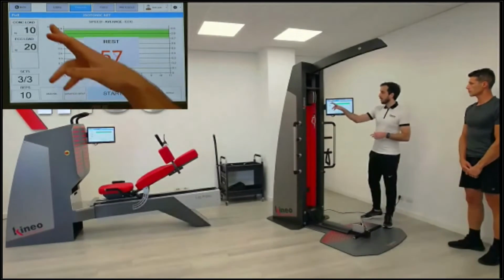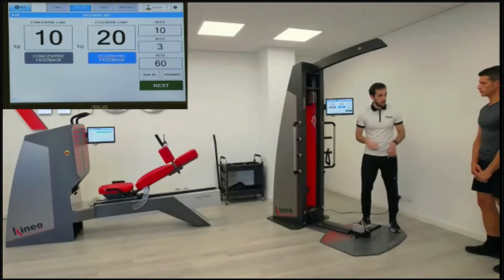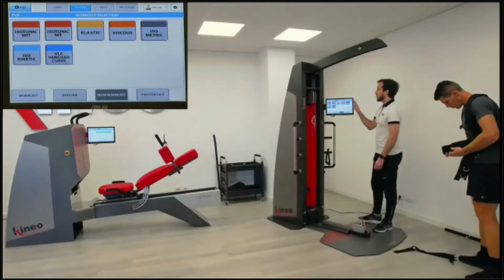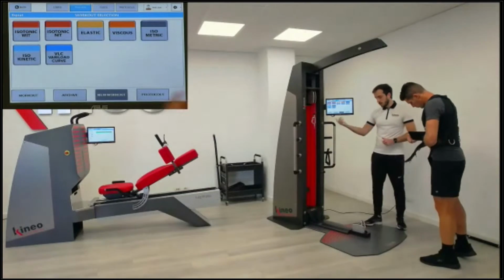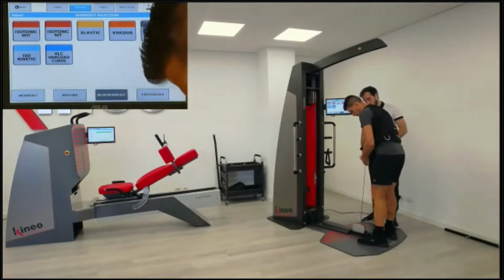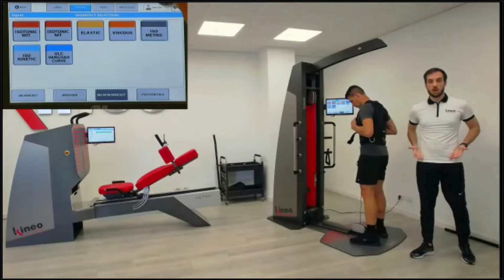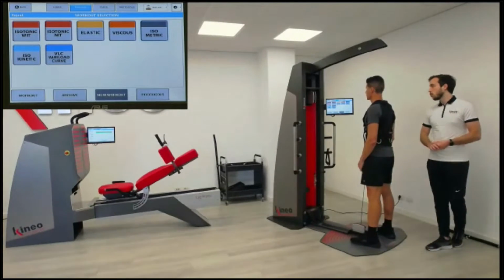And as we understood how easy this is, we can then practice, for example, a squat exercise. So please, Damiano, take the jacket. Change the workstation from pulley to squat, as you can see here. So now the machine can understand what type of exercises we are doing. As you see, we use a jacket to do the squat exercise. We don't have something on our shoulders. The weight is not on our shoulders, but on our hips. So we must concentrate on the work of the lower limbs, and there is a proper back support also here.